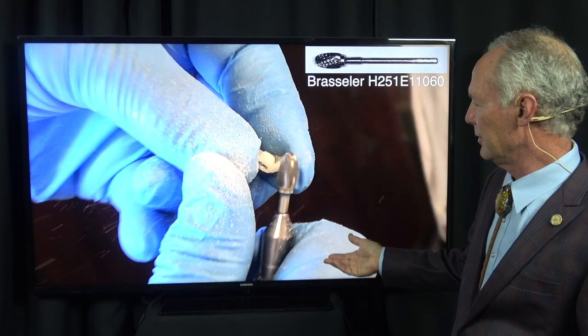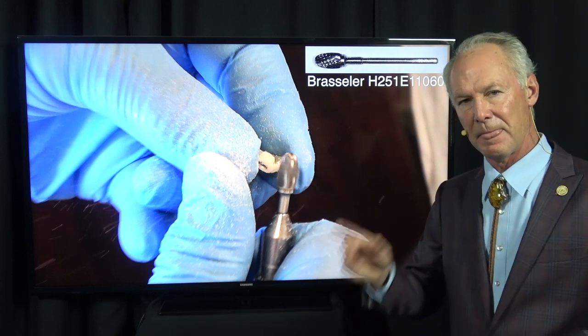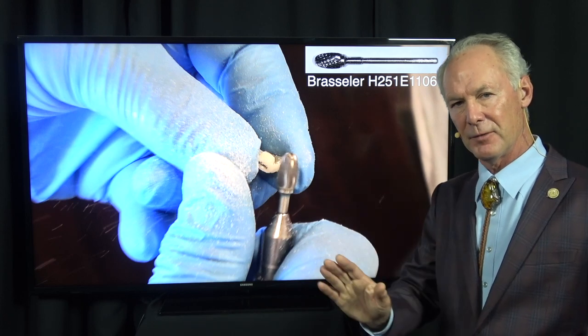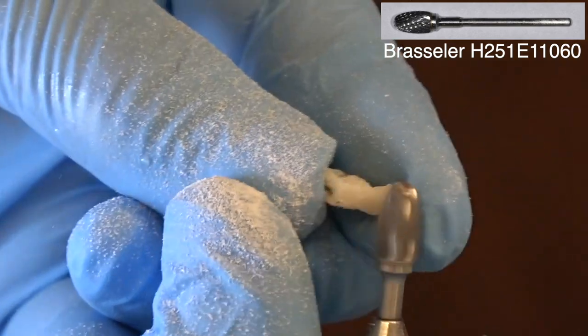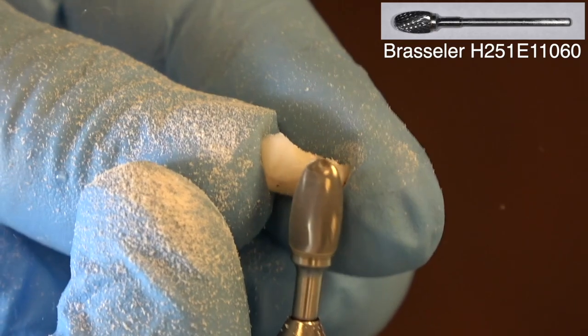For two or more crowns or veneers, I take a polyether and a reversible hydrocolloid. If it's a single crown or a single veneer, I take a full arch reversible hydrocolloid and either another full arch or a half tray. Usually I'll take just a half tray reversible hydrocolloid for the second impression, again, if it's just a single crown or veneer.